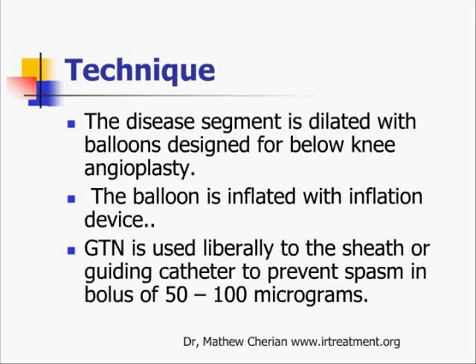The diseased segment is dilated with a dedicated balloon, which is necessary for below-knee vessels. The balloon is inflated with an inflation device. GTN is used liberally to ensure there is no spasm.